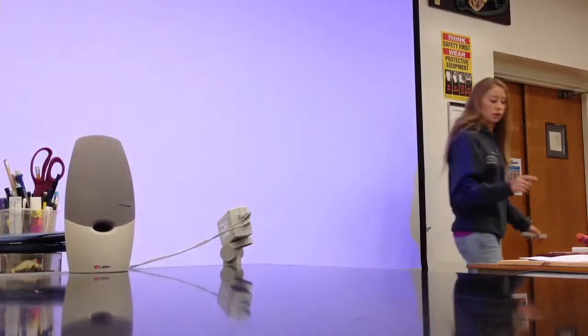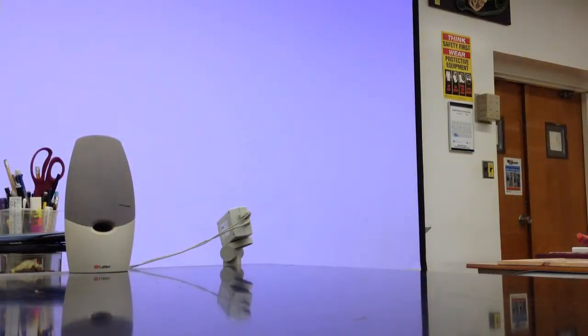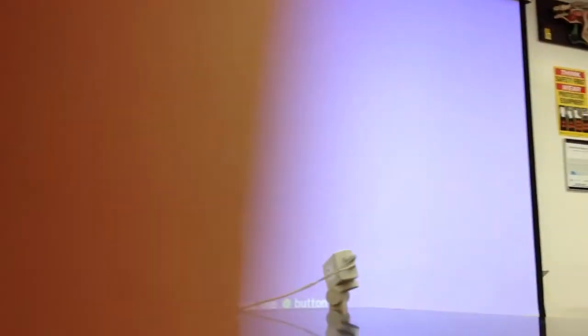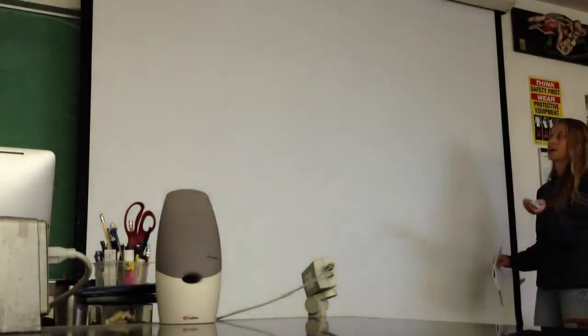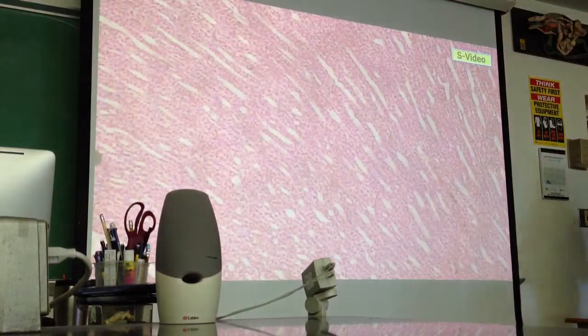Let me make sure that we're on the right thing. We'll get started on this video. I'll note the magnifications that I'm working with, but I don't expect you to really need to magnify any of these. We're going to be looking at some pretty general structures here.